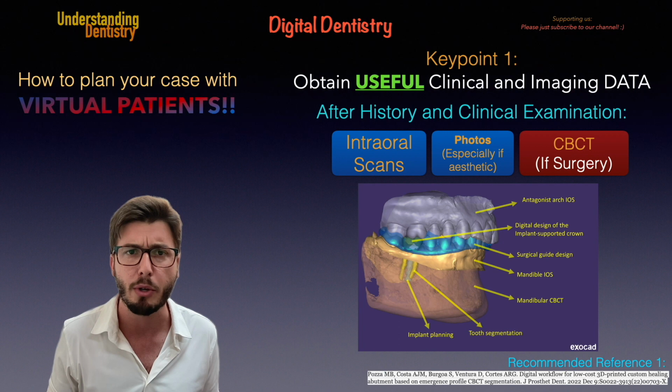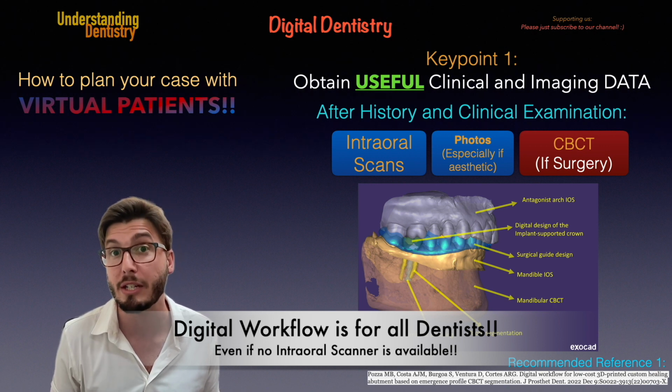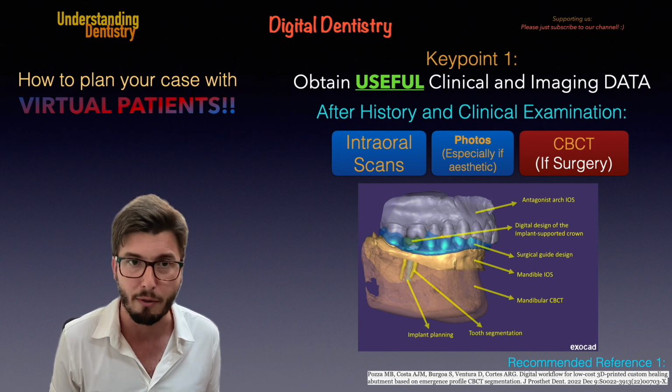And the first question that we always have is, are we able to work with virtual patients as dentists? And the answer is yes. We should be able to work with virtual patients regardless of the devices that we actually have. And the reason is very simple. There's always a way to move to digital workflow, okay?